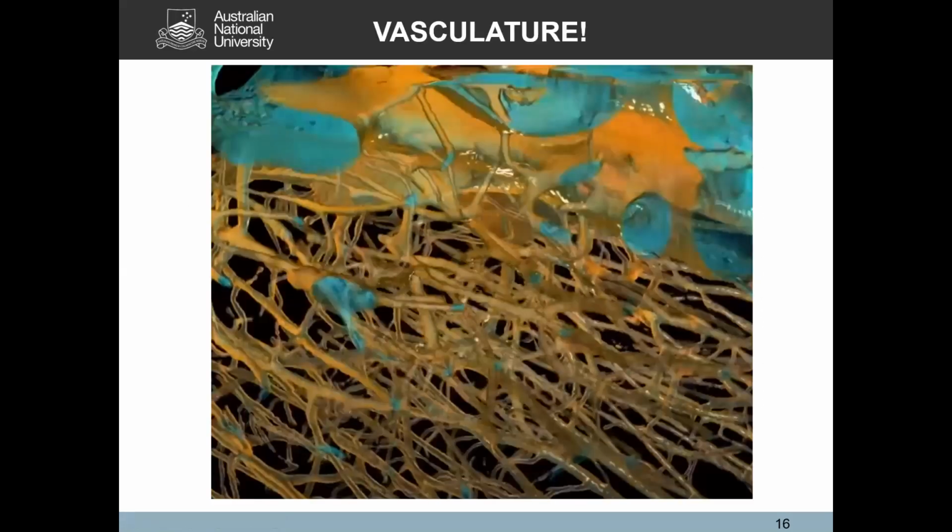And last but not least, most importantly, it's the actual vasculature of bone. In preparation for today, I asked you to have a quick look at a 3D render of a Haversian vascularity system in human bone. If you did have a look, it's one of the really beautiful aspects of microscopy that we can look inside your bone tissue. But it's an incredibly complex structure, and being able to figure out the size of these blood vessels and how they're connecting will give you very interesting information about how well or poorly vascularized a bone sample is.